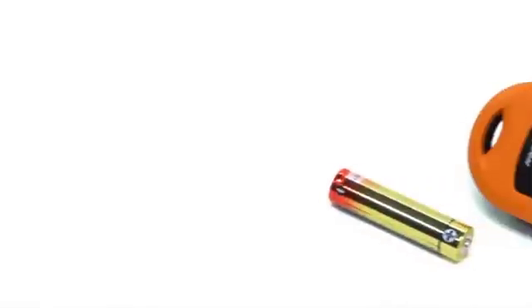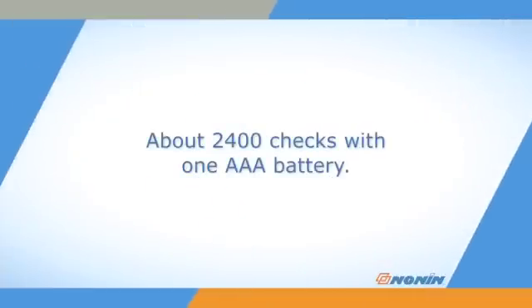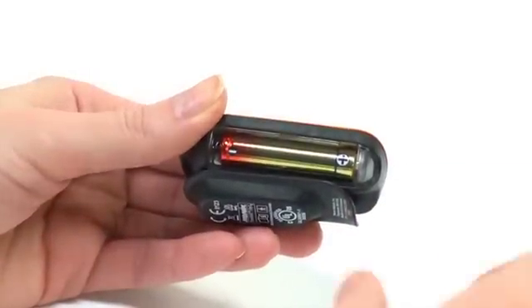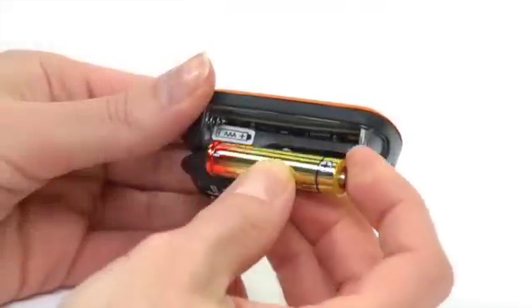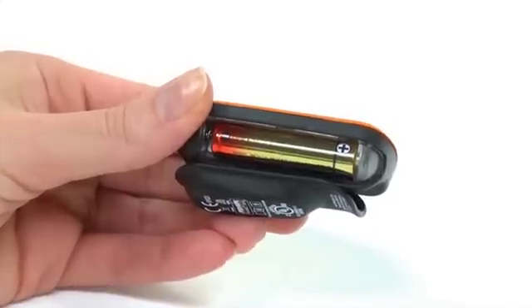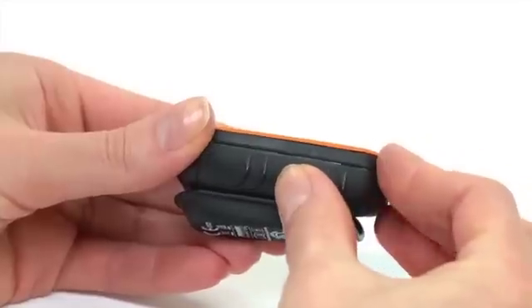The GO II Oximeter uses a single AAA battery for power. Each fully charged battery will perform about 2,400 spot checks. Battery changes are easy — simply slide off the battery door and remove the old battery. Insert a fresh AAA battery matching the positive and negative contacts to the markings in the battery compartment. Replace the battery door and you're ready to use the Oximeter.